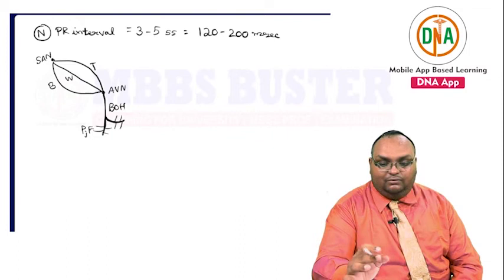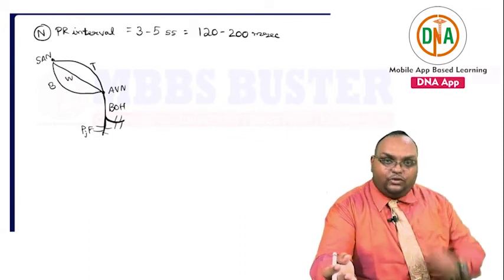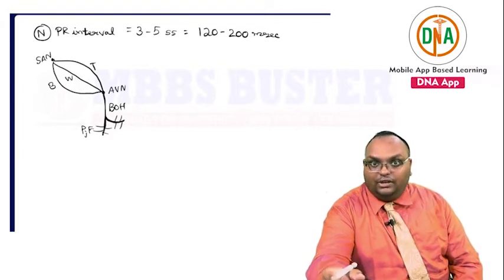The same diagram I am going to repeat three more times, so as to give you an idea about first degree heart block, second degree heart block Mobitz type 1, second degree heart block Mobitz type 2, and third degree heart block.